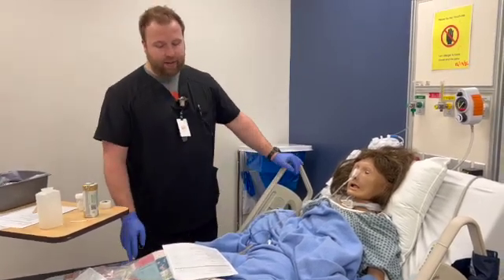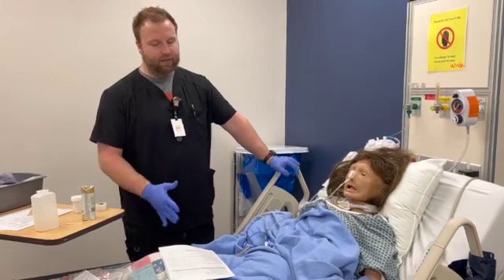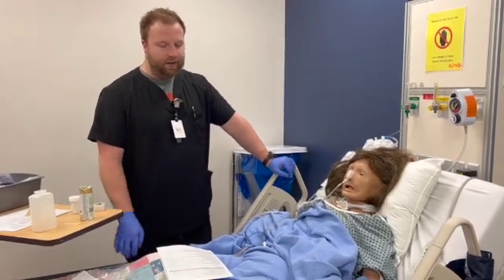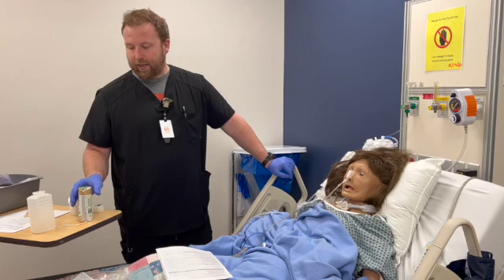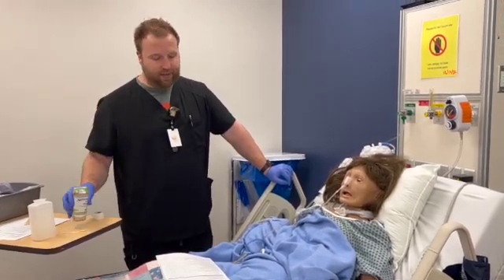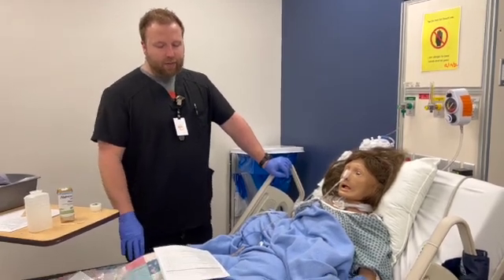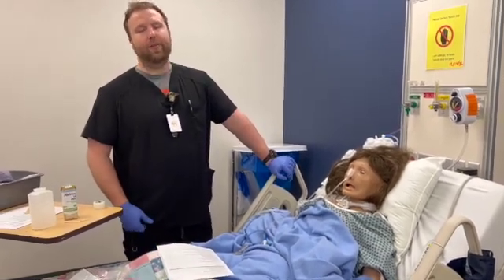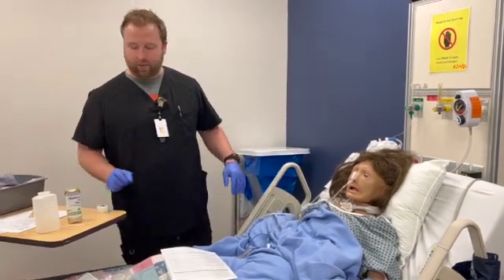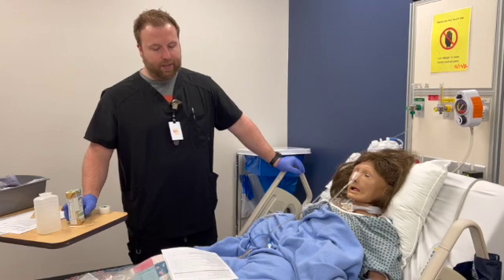Once I confirm orders, I don clean gloves. I've got clean gloves on again. I'm going to check my feeding and expiration date. Your tube feeding will be expired, but you'll pretend that it isn't. We already calculated our dose. Review any pre-administration assessment information. That'll be, is the patient allergic or sensitive to anything that you're going to be given via the tube feed.